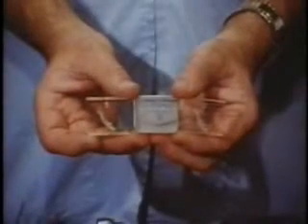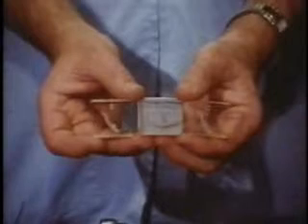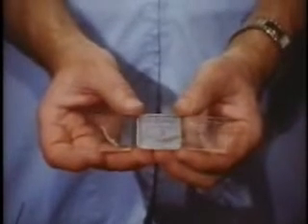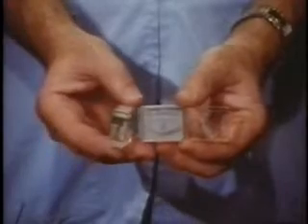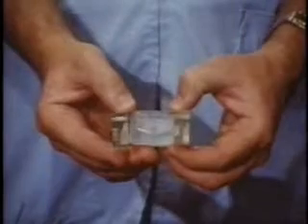Jaw movement characteristics differ from one individual to another and thus provide a very interesting subject for scientific study. This motion picture presents a new method of measuring and recording these movements by engraving them in clear resin blocks.